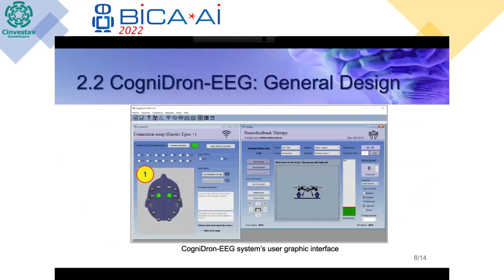On the general design of the system, this is the CogniDrone EEG graphical user interface. Sensors are selected by the therapist, who can know the signal quality based on the colors provided by the interface: green meaning good quality signal, yellow meaning medium quality signal, red meaning bad signal, and gray meaning no connection.